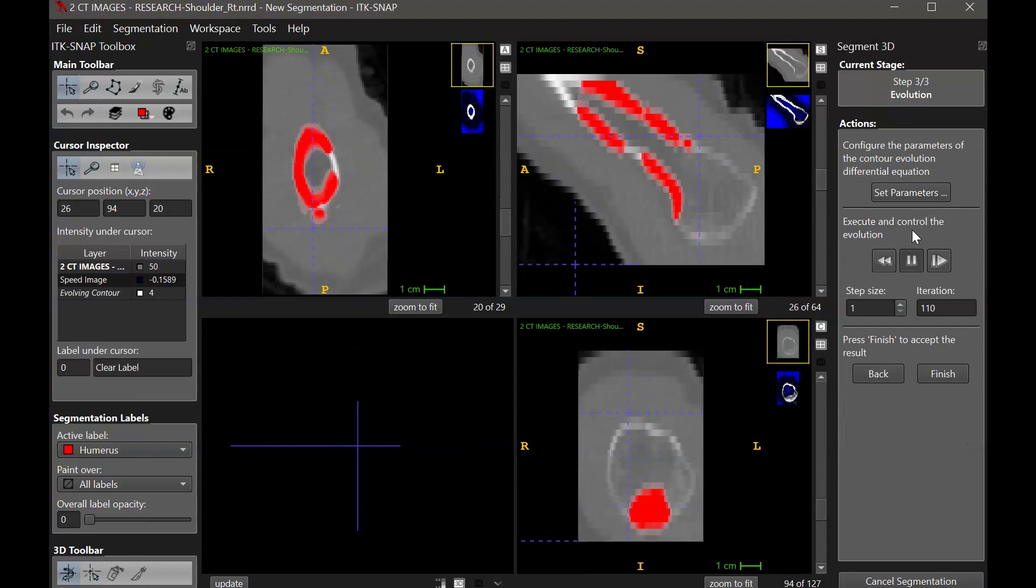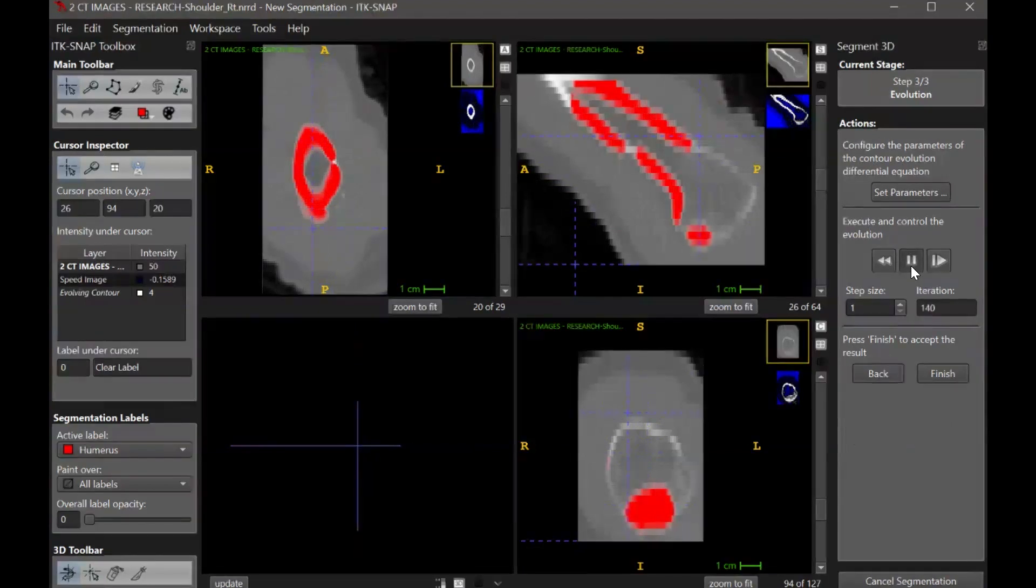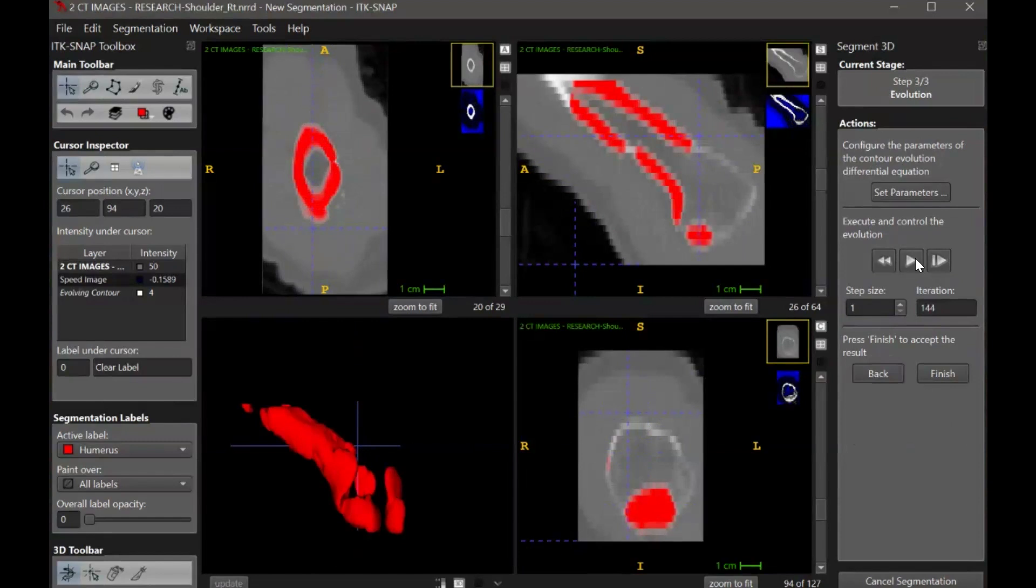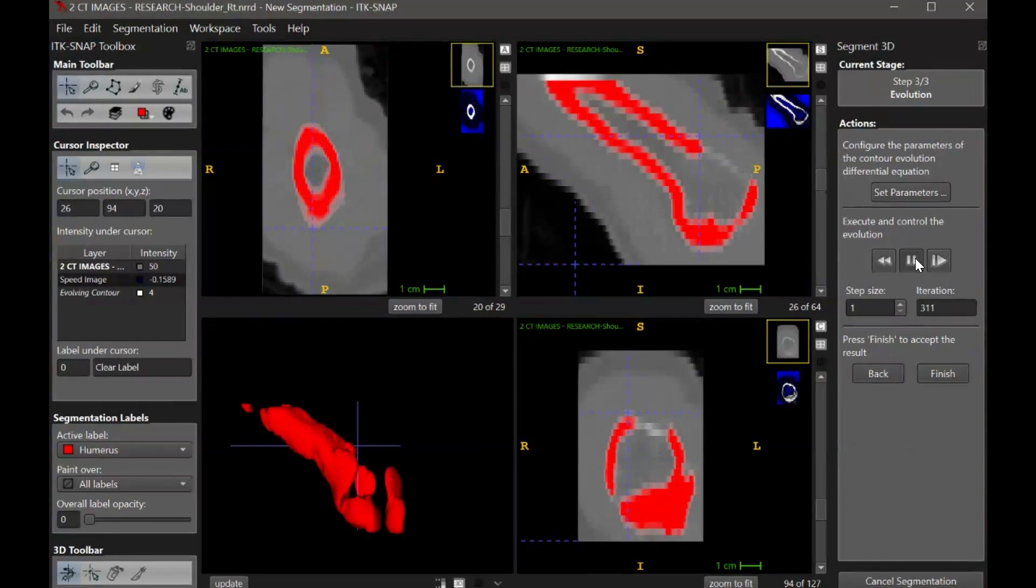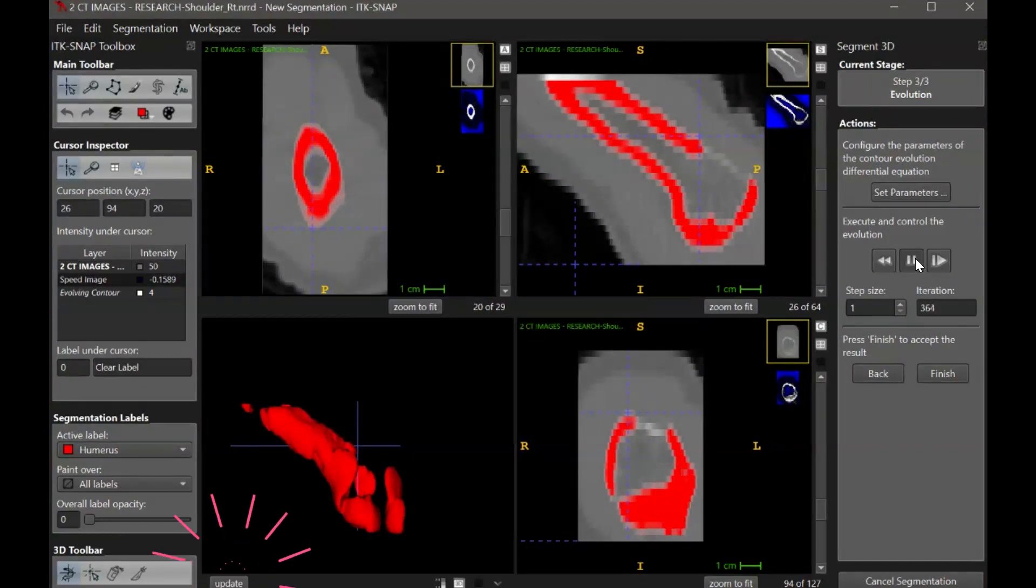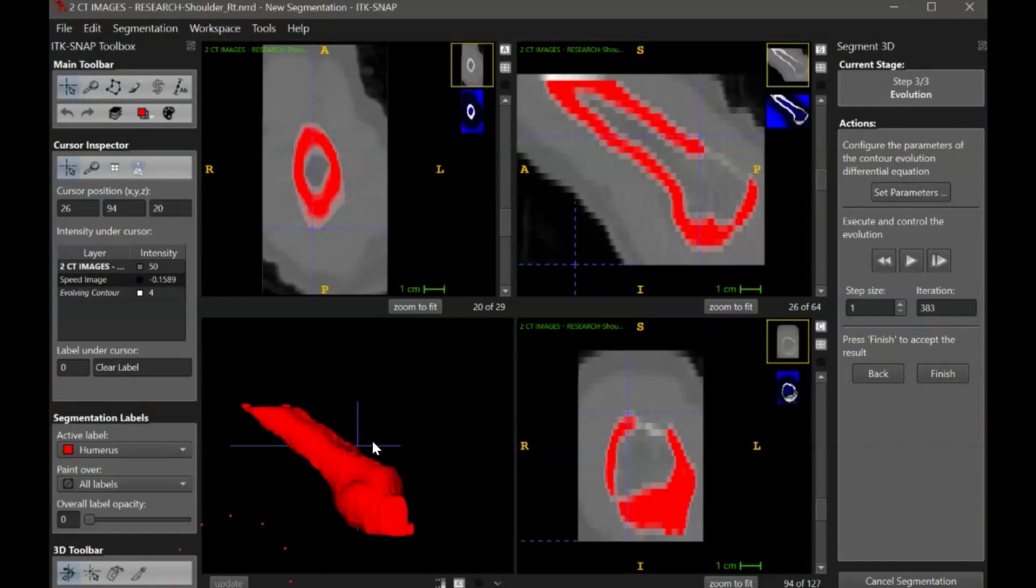Hit the active contour button and let this run for several hundred iterations. You should be able to visualize the segmentation growing in the image slice that you have on screen. You can also pause the contour evolution, click the update button, and see a preview of the 3D model that the segmentation is creating.